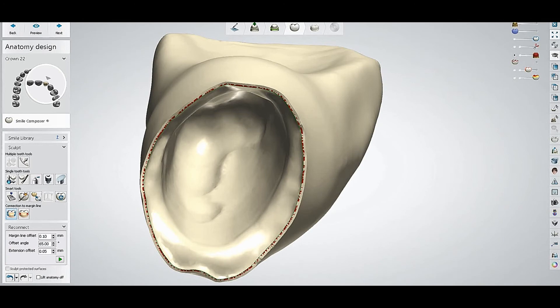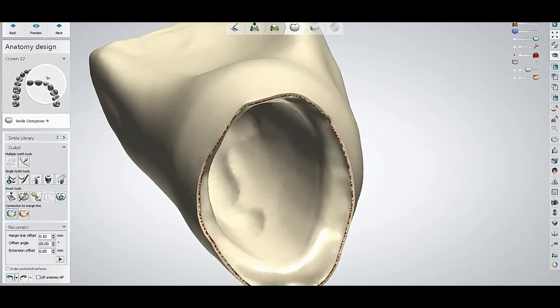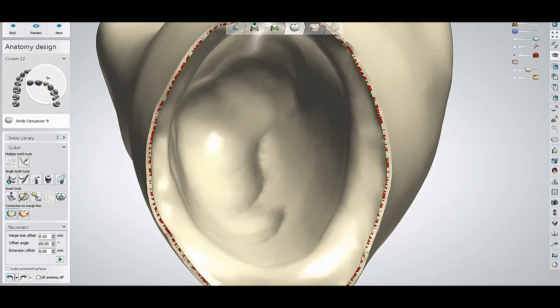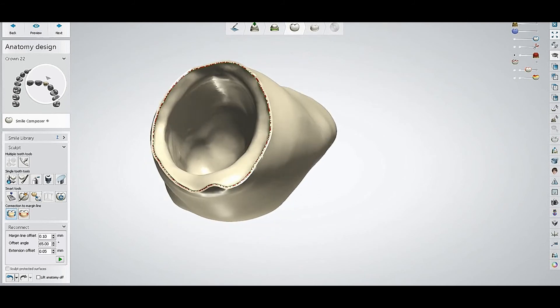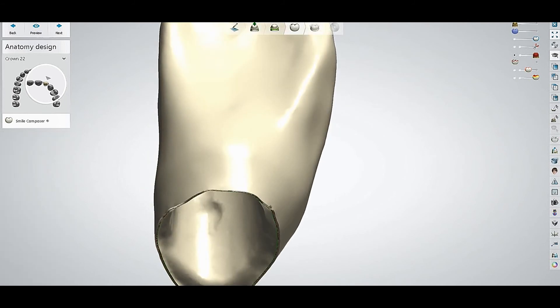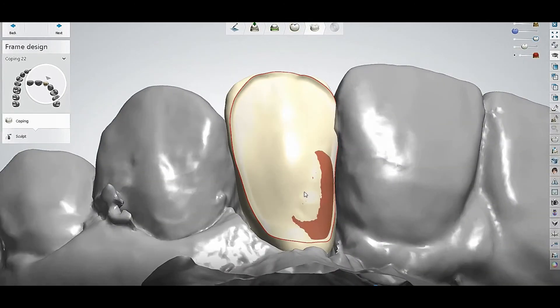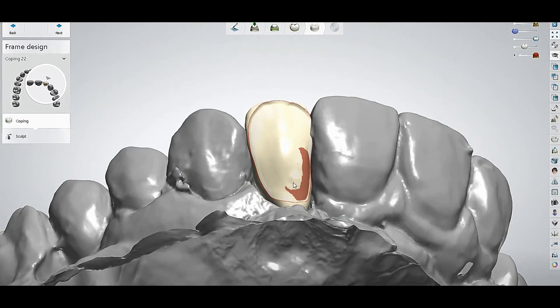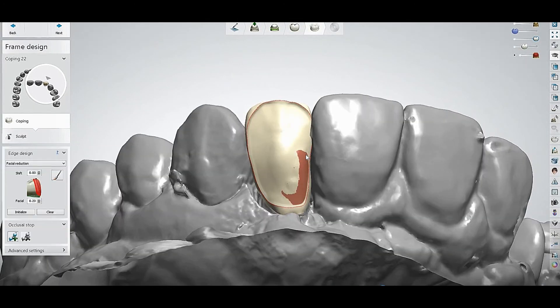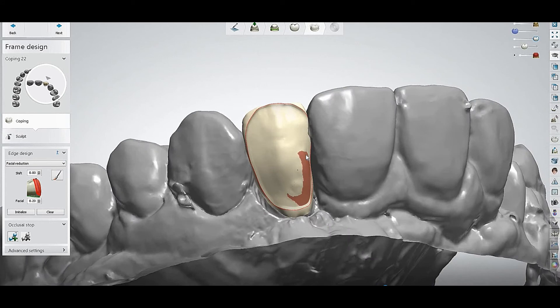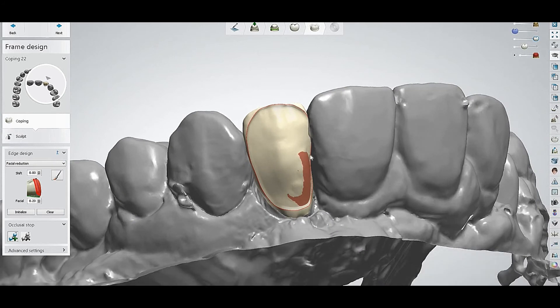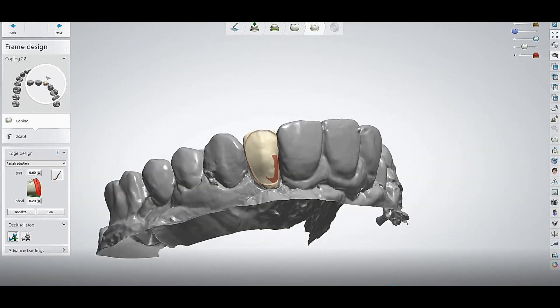Just reconnect the margin line. After reconnecting, you will find the whole thing is very smooth — there is no more distortion. When you go to the coping section, you will see it is already done. If you are going to make facial cutback, it is already done.